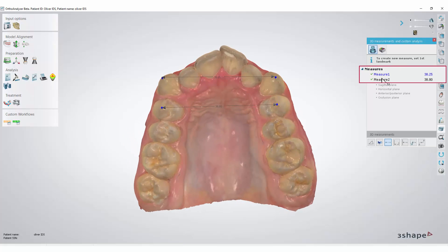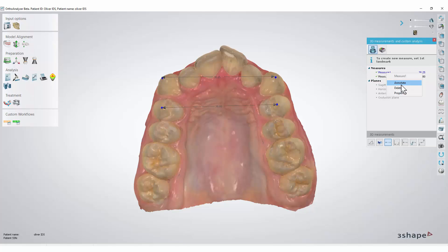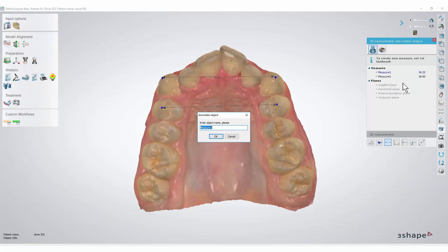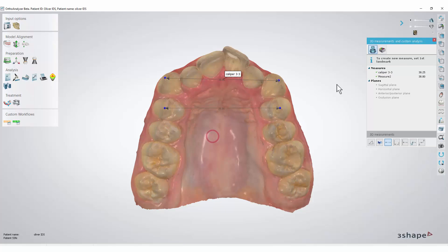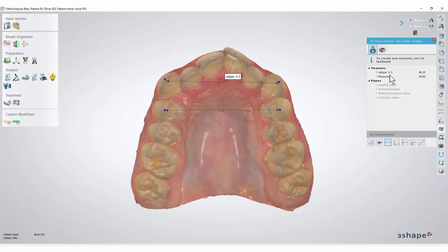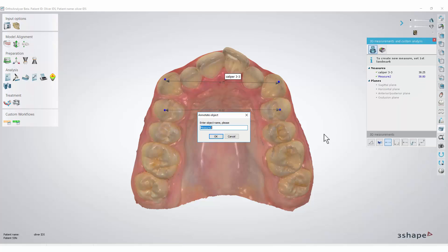All these measurements will be saved in a report. If you right-click one of them and select the annotate option, you can change its name. Click OK to confirm. It is important to remember that by changing default names, it is easier to distinguish between many measurements.